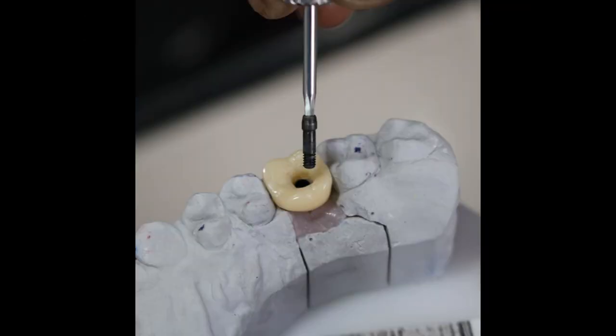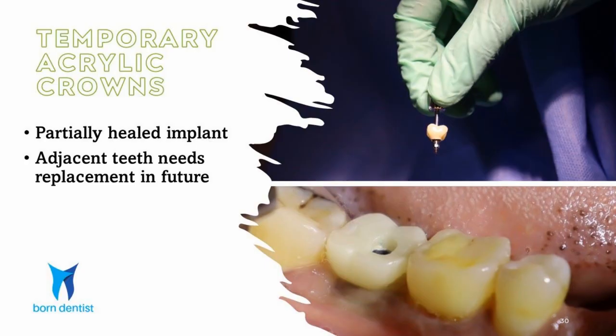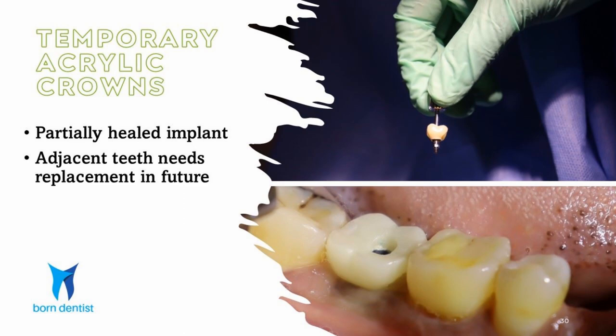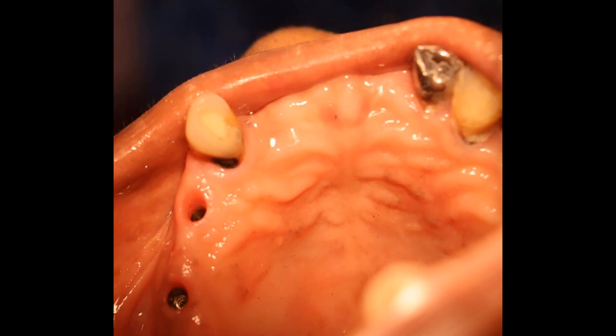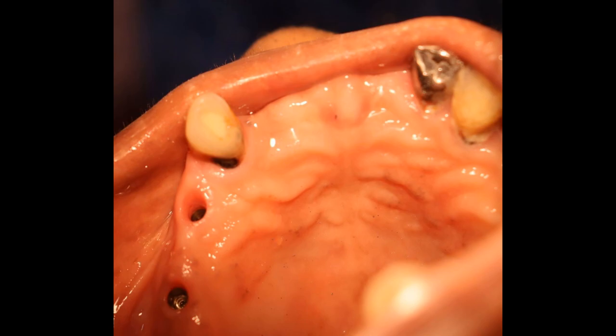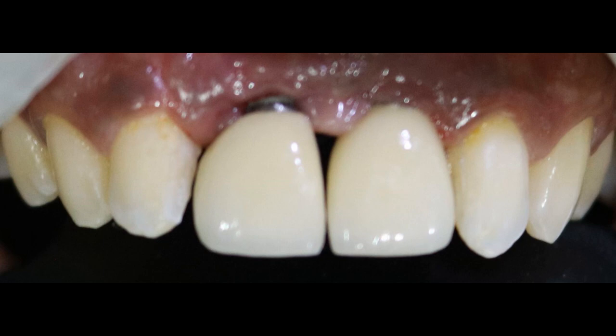As acrylic is less rigid compared to ceramic or metal, the load onto the partially healed implant will also be reduced. Another instance is when adjacent teeth are compromised and you might want to use the current implant for a future FPD or implant-supported overdenture. In such instances, retrievability of the current restoration is needed, so a screw retained is preferred. Similarly, when you anticipate soft tissue augmentation in a case, a retrievable crown is of great help.